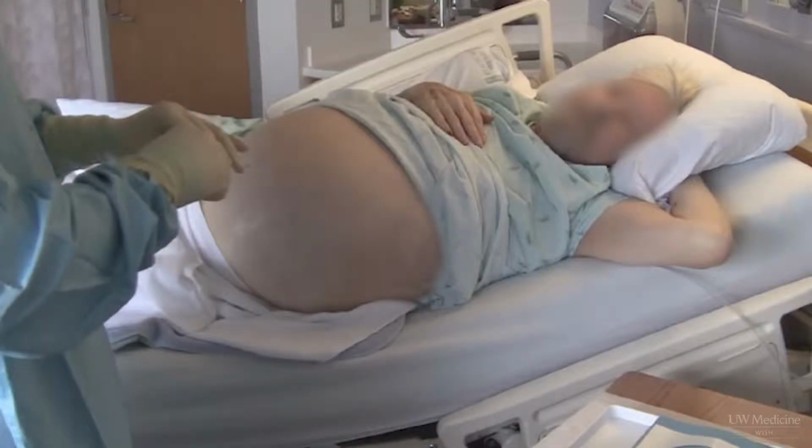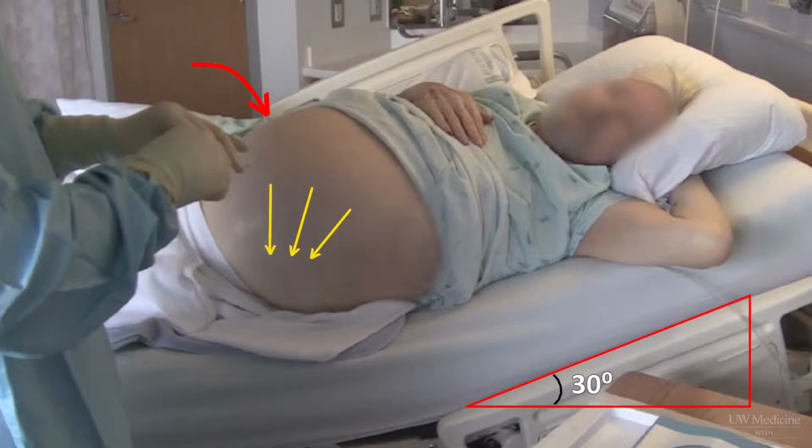Positioning for paracentesis is important. The patient should be supine. Placing pillows under the patient's flank, contralateral to the side of needle entry, and elevating the head of bed 30 degrees can help optimize the size of the visualized fluid pocket by shifting fluid into the planned area of needle entry.